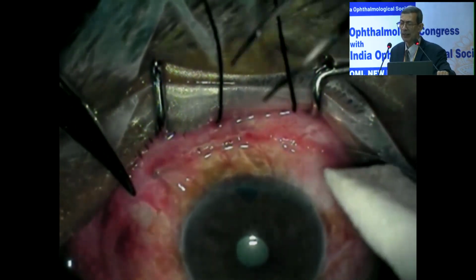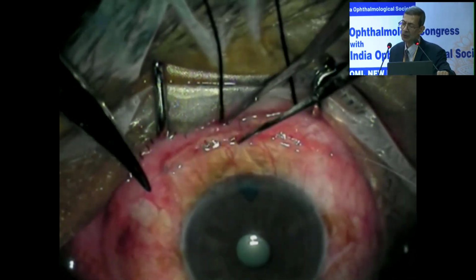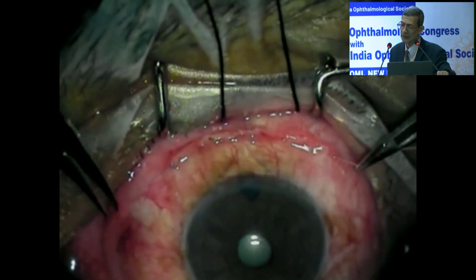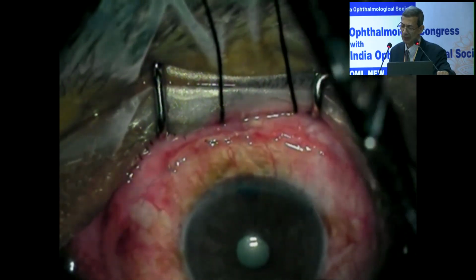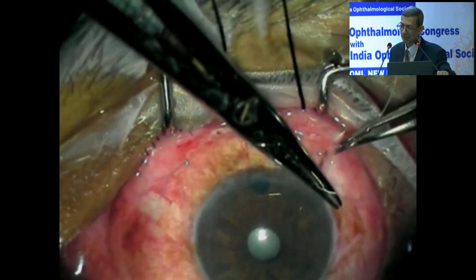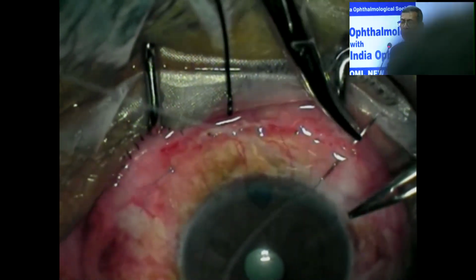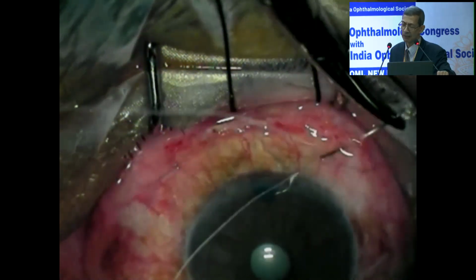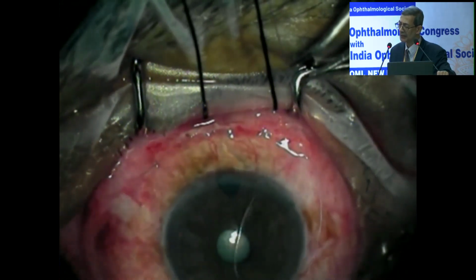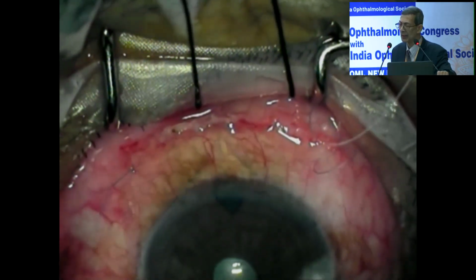Inspection should be done that the entire length of the conjunctivotenon layer incision is positioned very well, and a permanent knot will be given on the other side. You can see here. Now this is the end. You have seen I have not given any paracentesis opening. I have not done any flow of fluid, ringer lactate or balanced salt solution, in the anterior chamber.